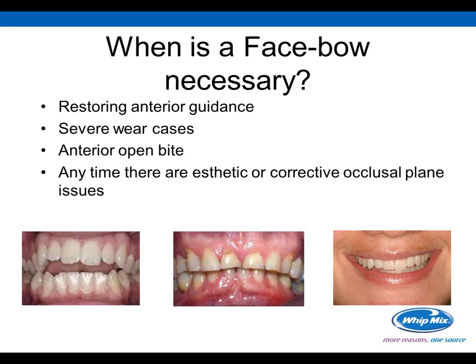So that leads us to wonder, when is a Facebow registration really necessary? I can honestly tell you that not every case needs to have a Facebow registration and then mounted on a semi-adjustable articulator. If the patient has a normal, healthy dentition, if they don't have any signs and symptoms of occlusal disease, it's perfectly okay to mount the case in maximum intercuspation, or maybe even use one of the arbitrary mounting stands that I showed, or just use anatomical averages.